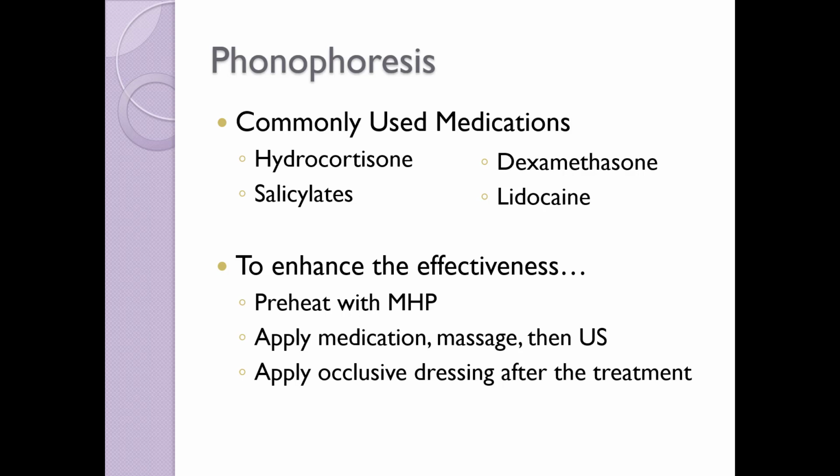The moist heat also hydrates the stratum corneum, which will assist with the transfer of ultrasound through the skin and aids in the diffusion of medication across the skin barrier. Another strategy to increase the effectiveness of phonophoresis includes applying the medication to the skin and massaging it in, but be sure to wear a glove if you are the clinician, so you are not receiving the effects of the medication as well.